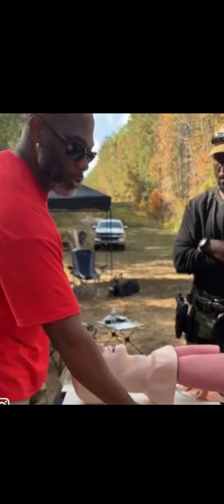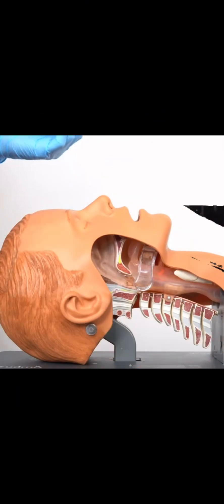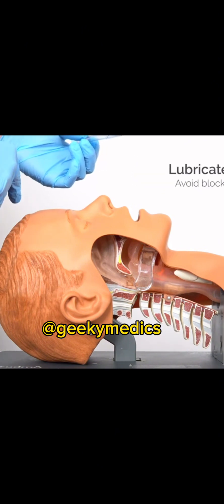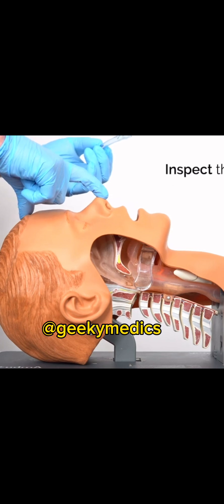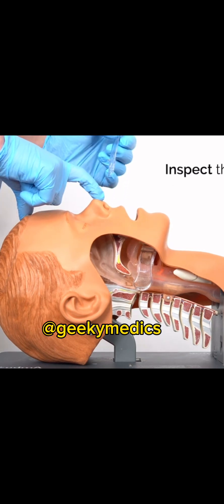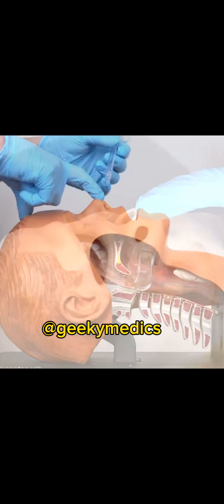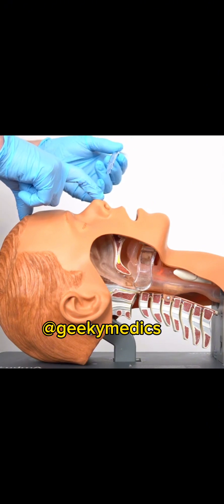Everyone grab one and go ahead and put it in the nose — it's as simple as it feels. In this position I'm in a good position to see everything I need to see. I've got some lubricant on the outside to help. With my non-dominant hand, I'm just going to pull the nose slightly back so I can see which nostril is largest. In general we go for the right nostril first, but it's important to look and make sure there's no deviated septum or large inferior turbinates that may hamper insertion.